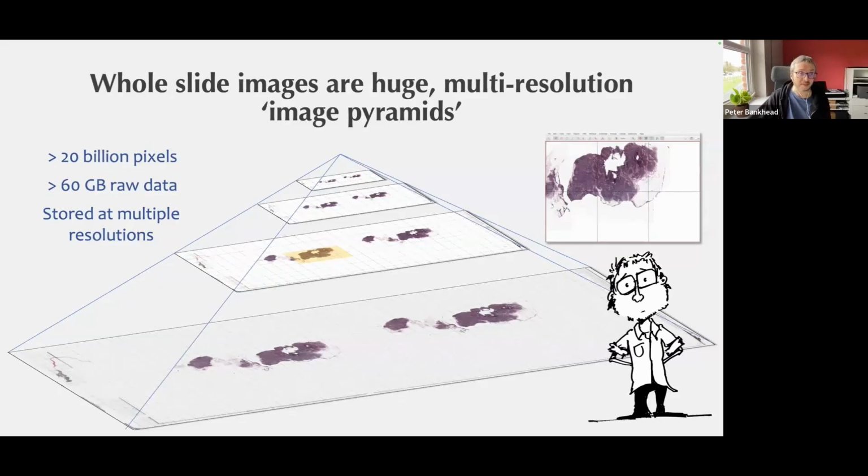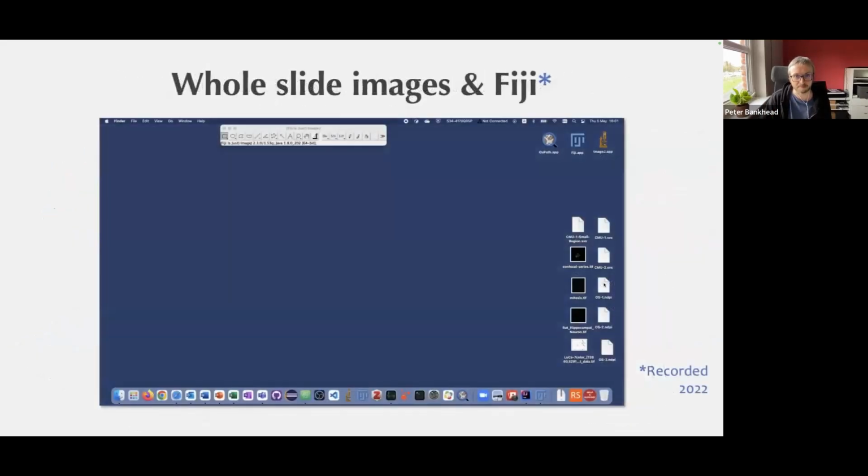And even if you did have an enormous amount of memory in your computer, it wouldn't be terribly efficient to try and read all of it in one go. So I ended up creating QuPath in order to be able to handle these kind of images efficiently.